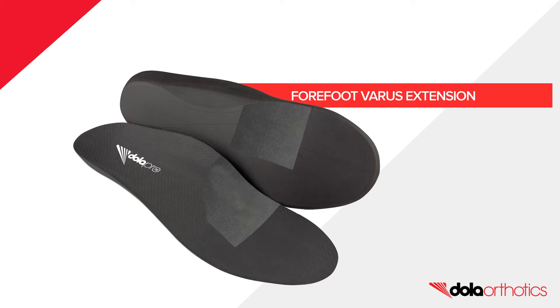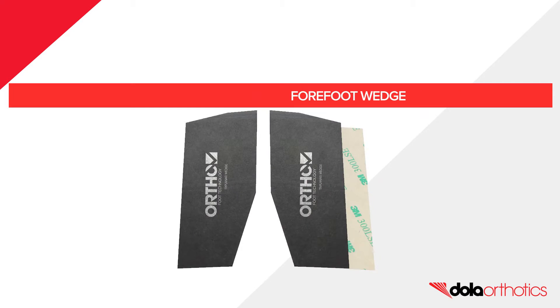Forefoot varus extension: dorsal and plantar application. Introducing the Dollar EVA forefoot varus extension, available as a single size wedge with the ability to modify and apply either dorsally or plantarly.